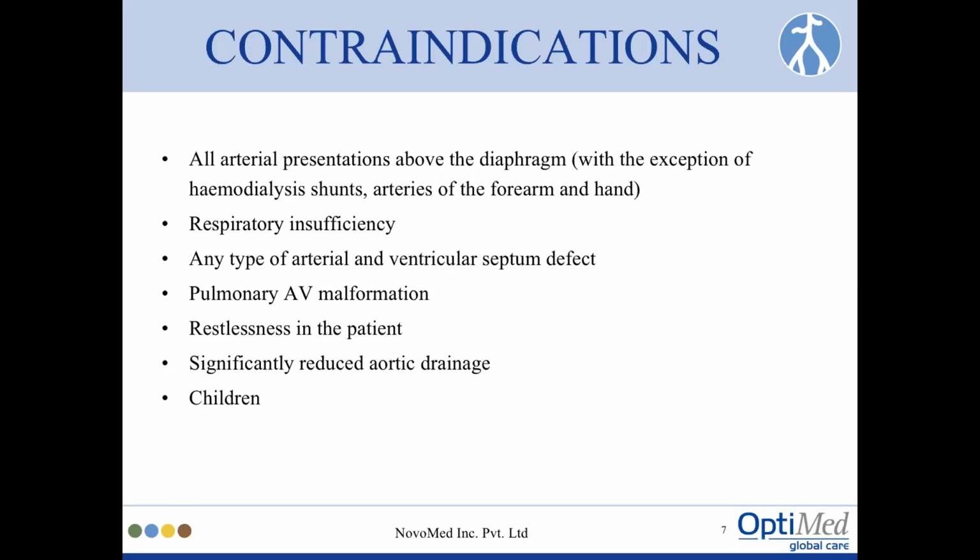If you've been doing years of angiography and you're used to a brilliant picture, then in the initial phase it is sometimes a little bit difficult to reconcile yourself to the fact that these pictures might not appear as brilliant as conventional contrast. And so you need the patient to lie still. If the patient is restless and moving around, then it may not give you as good pictures as you would expect to get from a conventional angiogram.